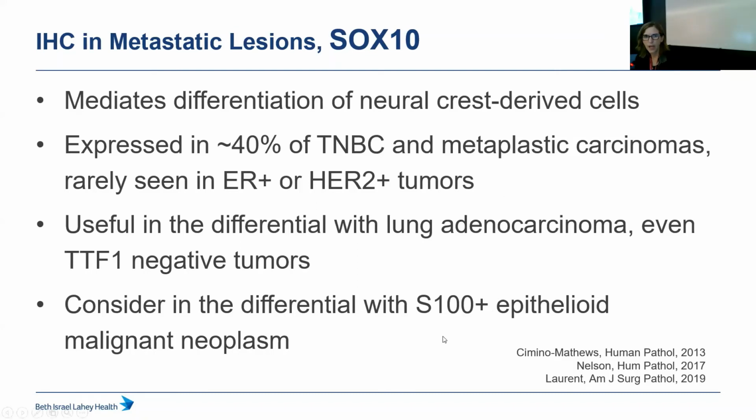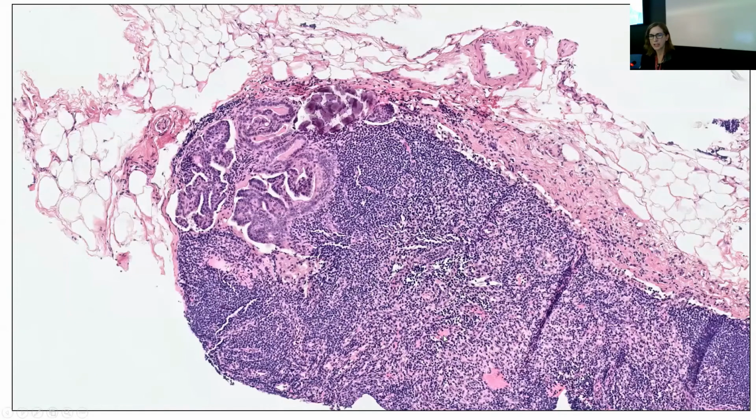And then here's a fun case for us pathologists, not for the patient, obviously. This was actually an intraparenchymal lymph node. The radiologists thought it was an intraparenchymal lymph node, but they thought that there was some irregularity and some calcifications on imaging studies. So they did a biopsy.